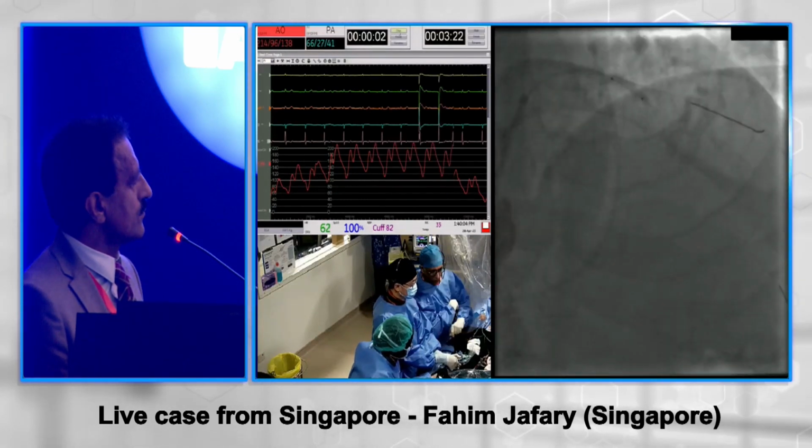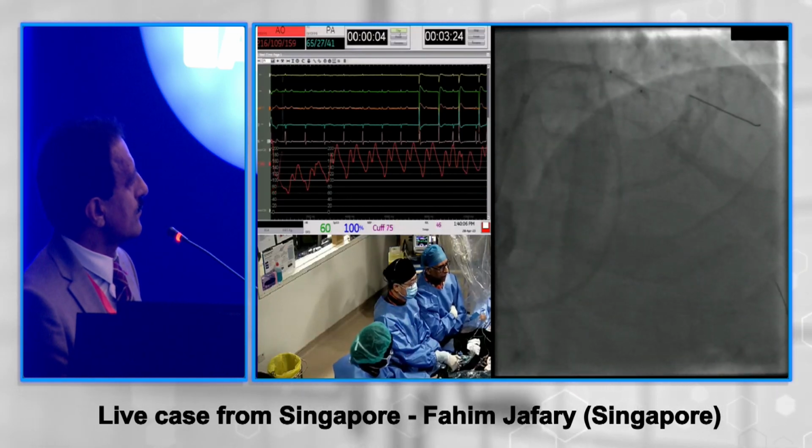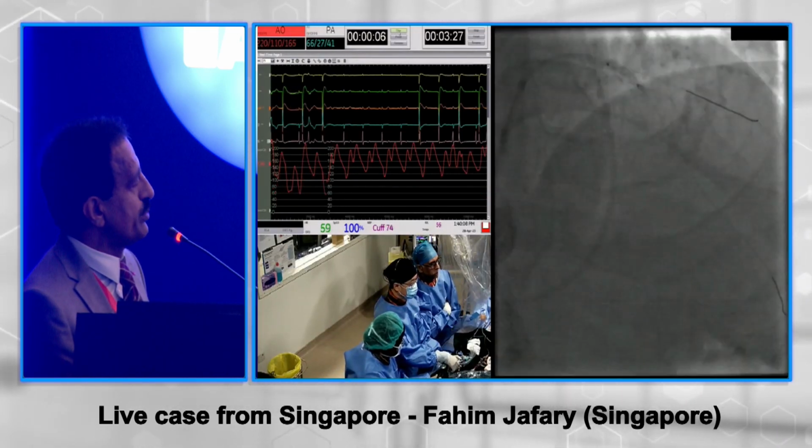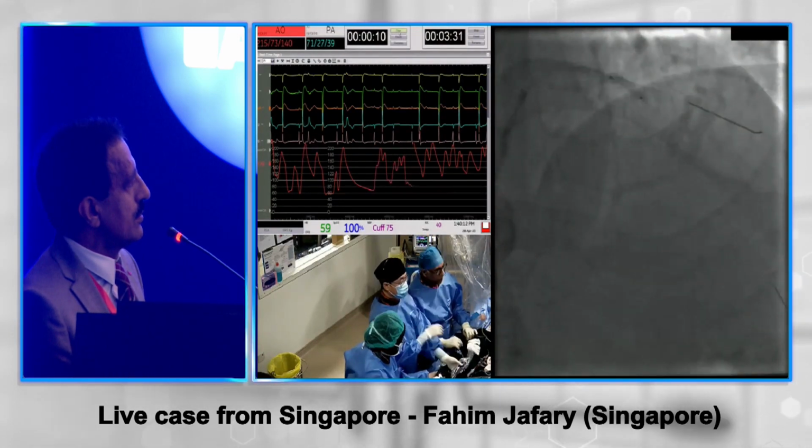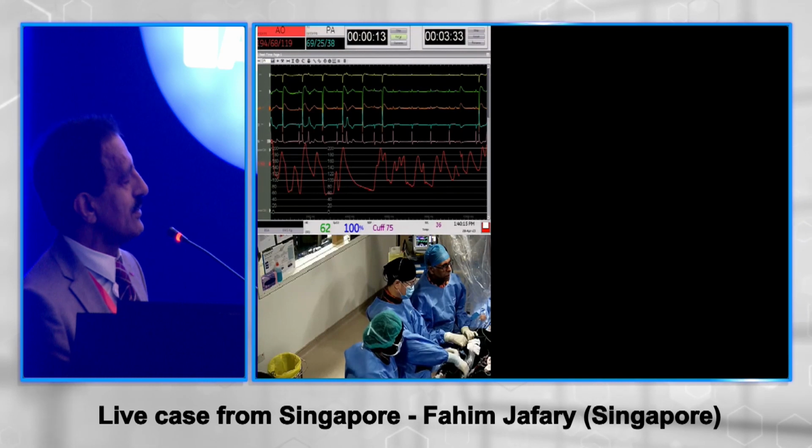So this is the IVL now, and we're going to crack it. Yeah. So what size OPN did you take? Maybe a little bit. This is IVL, 3.5 by 12. Sorry, yeah, IVL, 3.5, sorry.